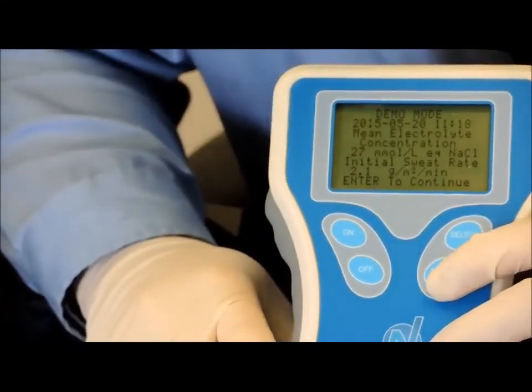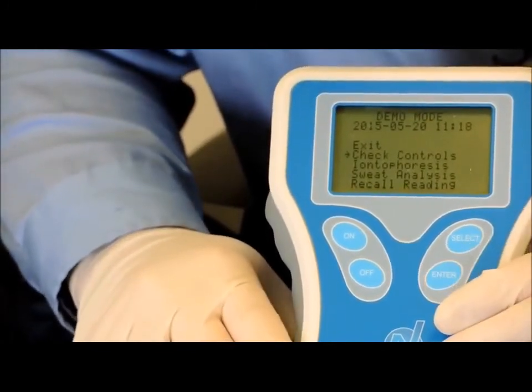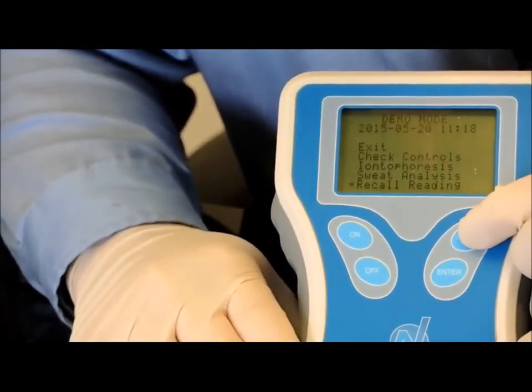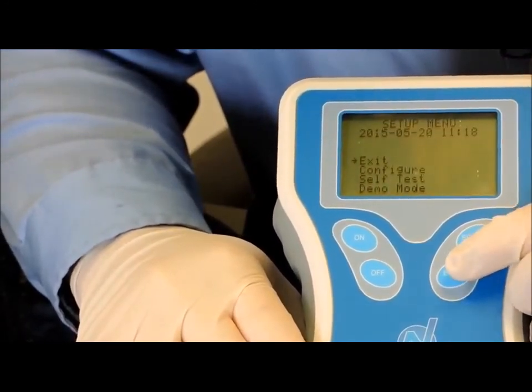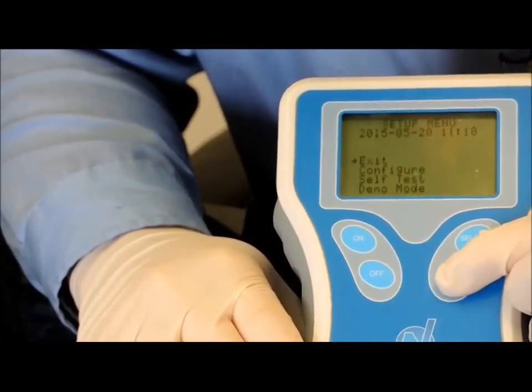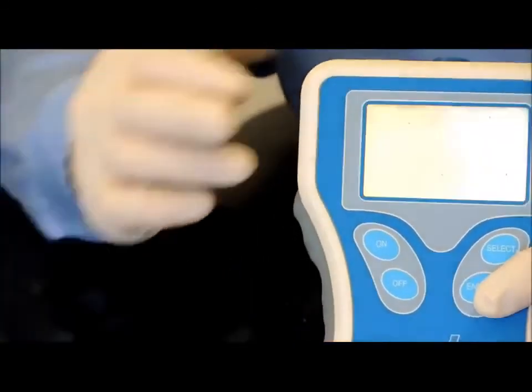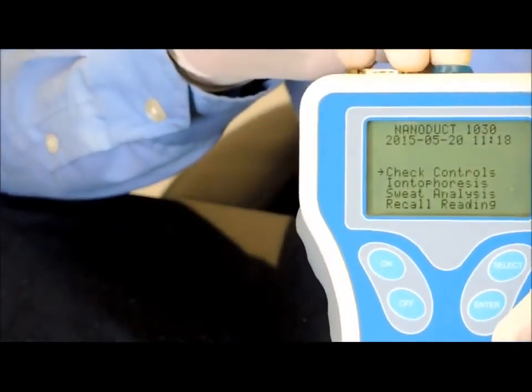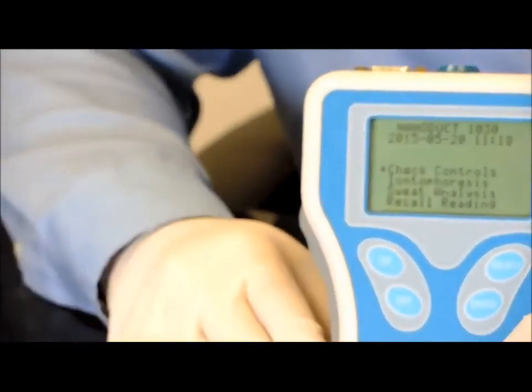And when you're complete, just like a normal test, you can recall the reading and see what the reading was. And when you're done with the demo mode, you can select the exit and exit out of demo mode and the setup menu and get back to the normal screen, where it would require you to have it connected to a patient for any of those progresses to occur, the iontophoresis or the sweat analysis.